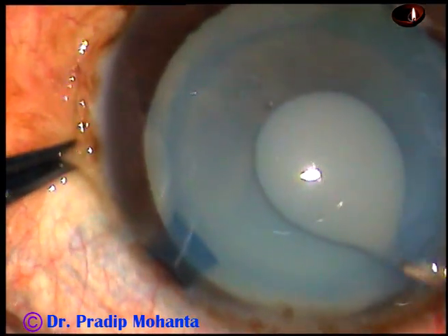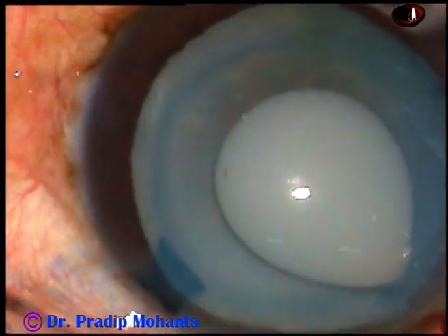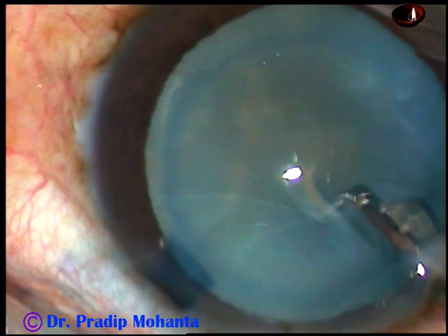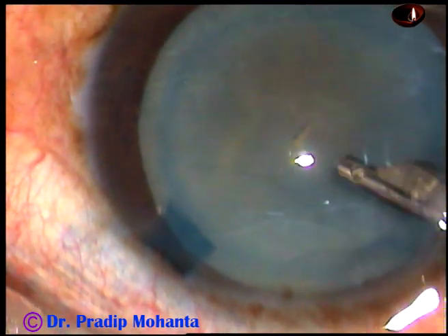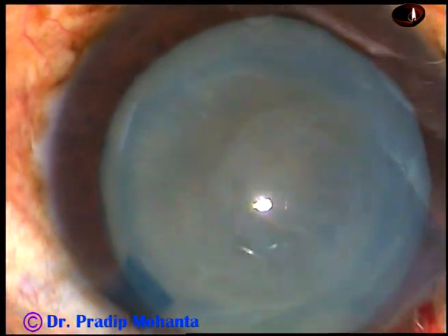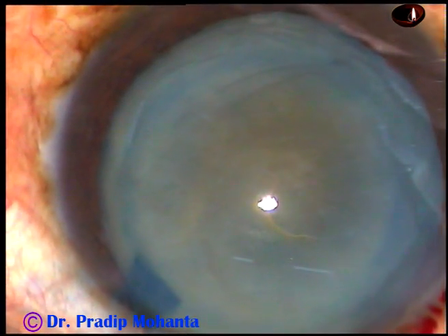Now, with the help of a 26-gauge bent cystitome, I make a puncture at the center of the anterior capsule and immediately milky fluid comes out. Then I use the Simcoe cannula again and wash out the milky fluid. And now the anterior chamber is filled up again with 2% HPMC.